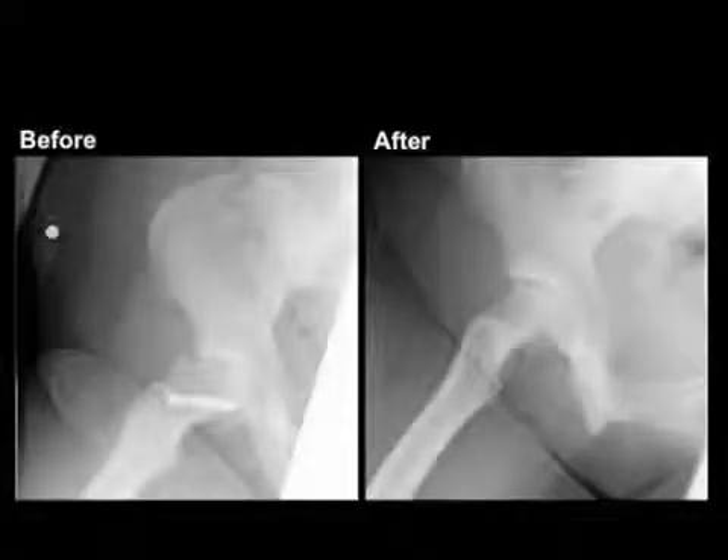This is a very powerful technique where we can make larger corrections as in this patient, or more subtle corrections as we see in this patient where only a small recontouring was necessary.